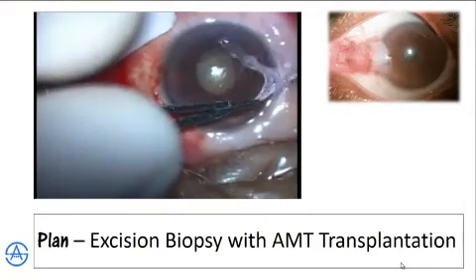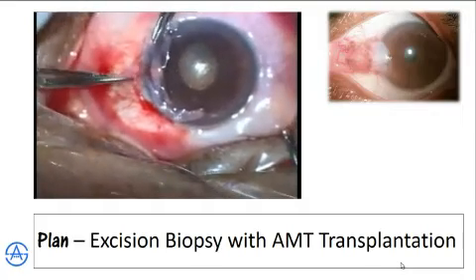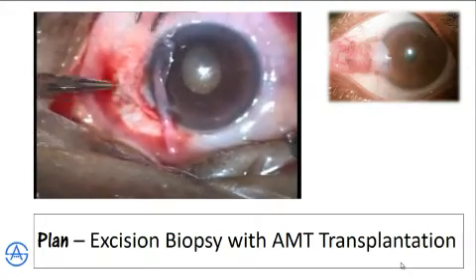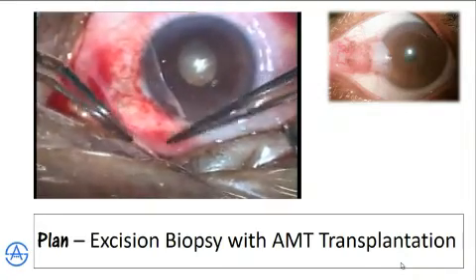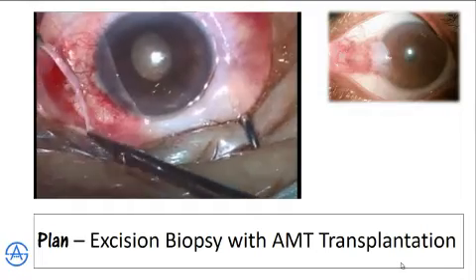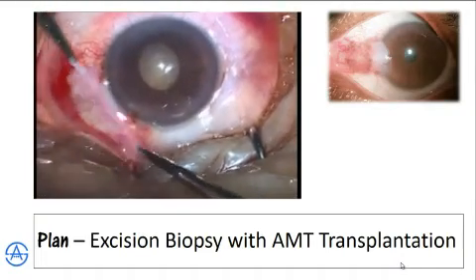First, the amniotic membrane was peeled off, and the size of the amniotic membrane taken is confirmed for its dimensions, with the epithelial side up. Then it is kept on the corneal surface with epithelial surface down, so as to instill glue.